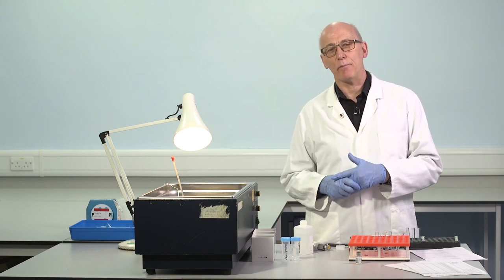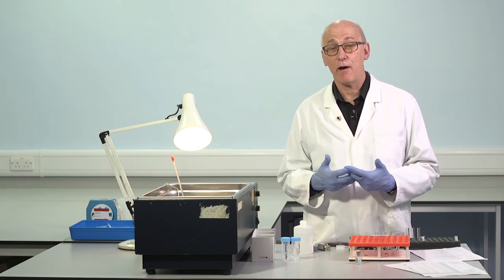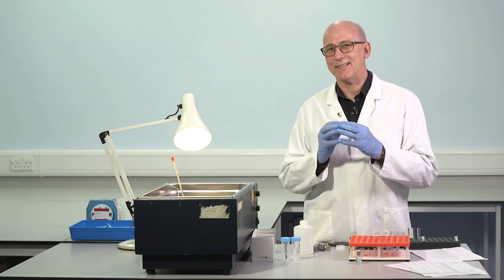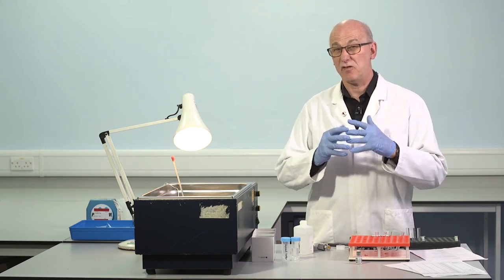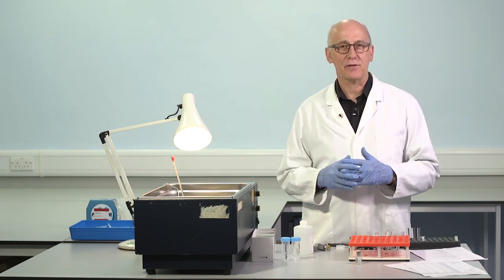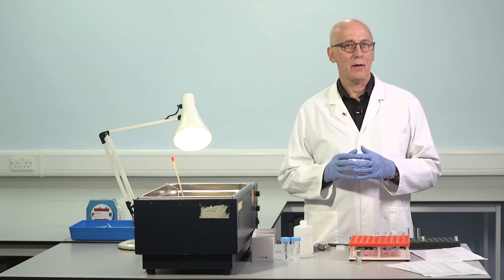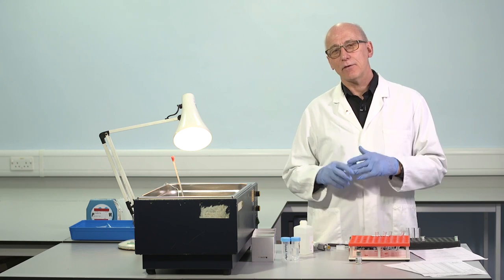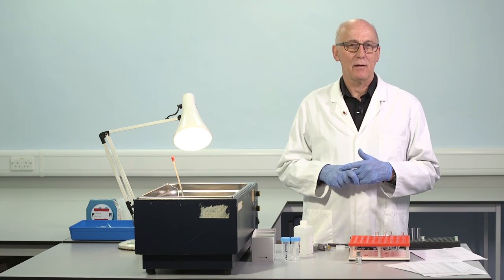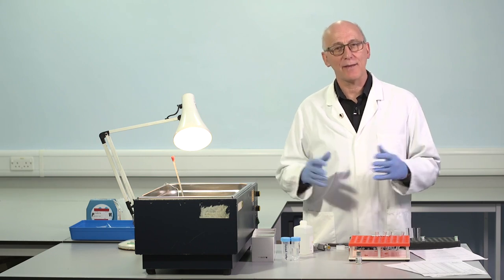This is a factor VIII assay we'll be performing. We know that factor VIII assays are subject to some assay variability. It's not possible to remove that. So if the true level is exactly the same as the control mix, if it truly is 100% of the control mix, when we make the assay, we might get 100% or 95 or 105 or somewhere close to 100, because we know the assay is a little variable. So if the residual factor VIII lies between 90% to 110%, we're confident there's been no change relative to the control mix. 0 antibody, negative.